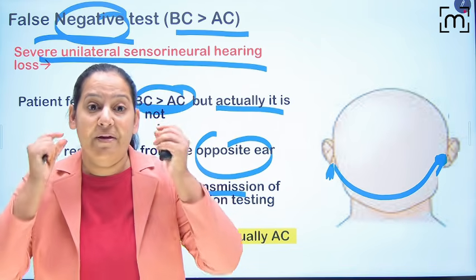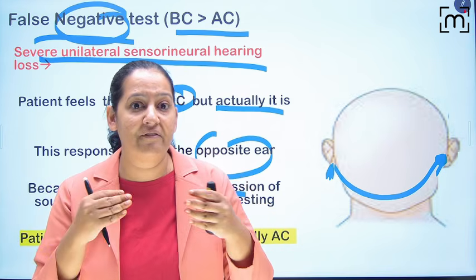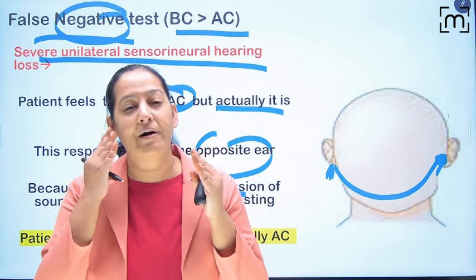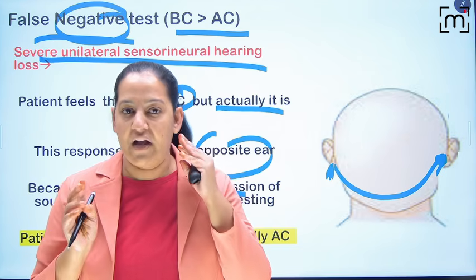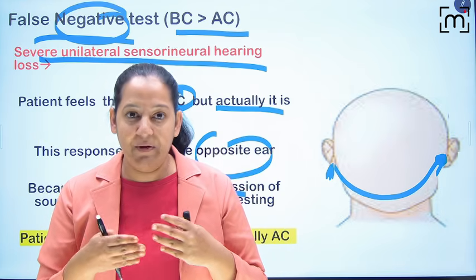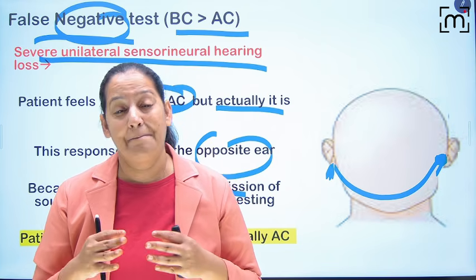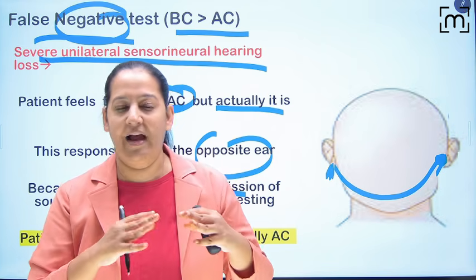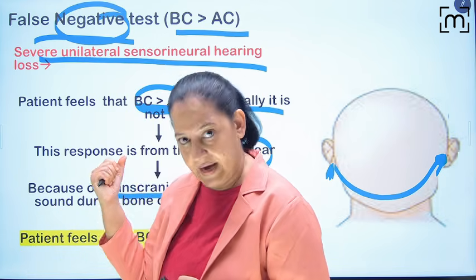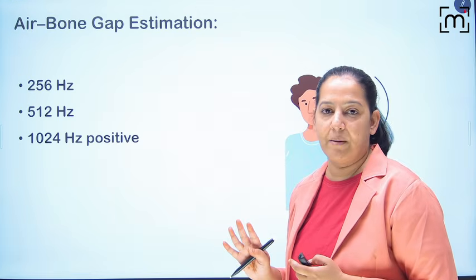If anyone is having bilateral hearing loss, we will talk about the 2 ears in terms of better ear and worse ear. So the deafness is not equal in both ears. One ear will have less deafness, that is known as the better ear, and one ear will have more deafness, that is known as the worse ear. Then the results will be in terms of better ear or worse ear. The better ear will be considered as normal and the worse ear will be considered as the diseased ear. So in short, I have given you the answer, and I will teach it better after Weber. Okay, so this is what we have completed till now.